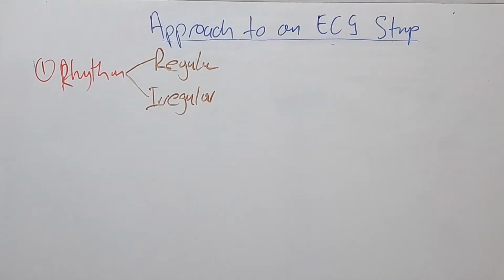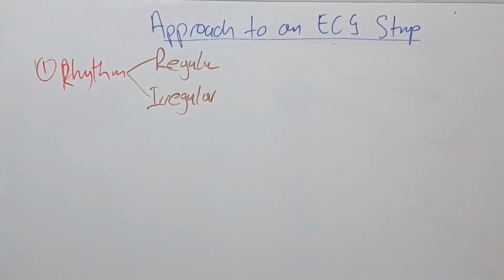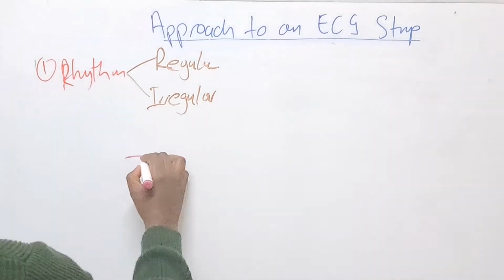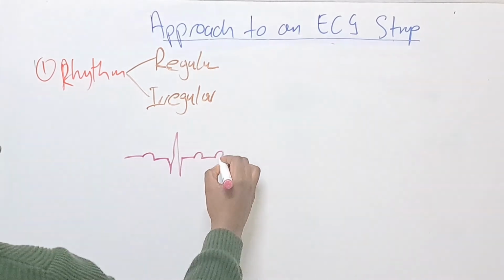And I said that there are a couple of methods that you can use to quickly figure this out.